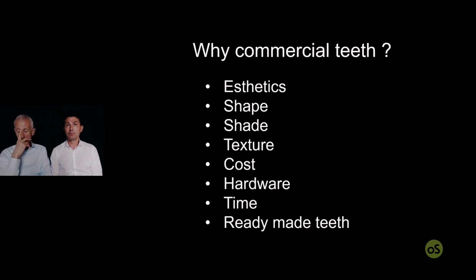Okay, let's say that for those dentists that like to do everything themselves, because many dentists will simply send and ask this to the labs, and the labs will basically do the job and the shell. But some dentists do every step, including the analog. And I think another advantage is that they do not require a big financial investment, as is normally required to buy a video, a camera, a mill machine, and so on.